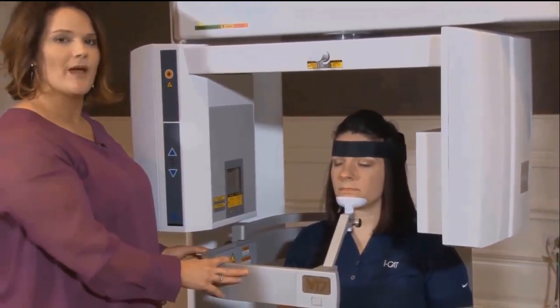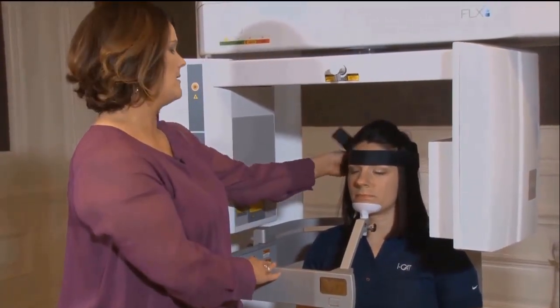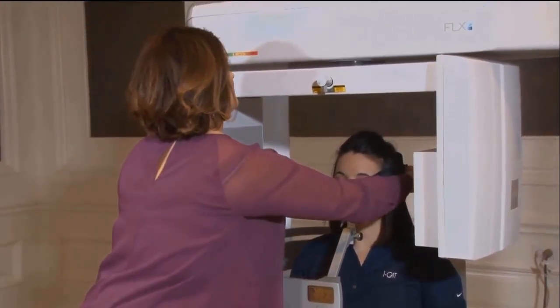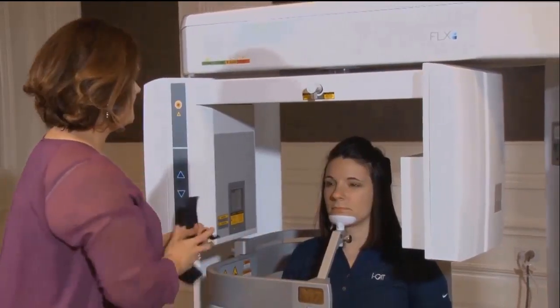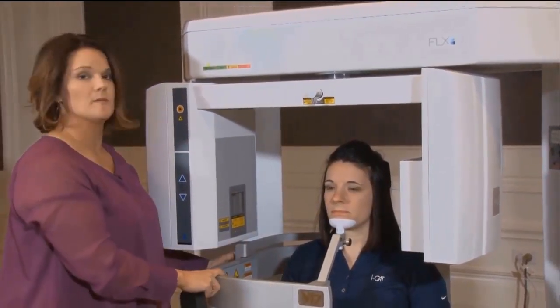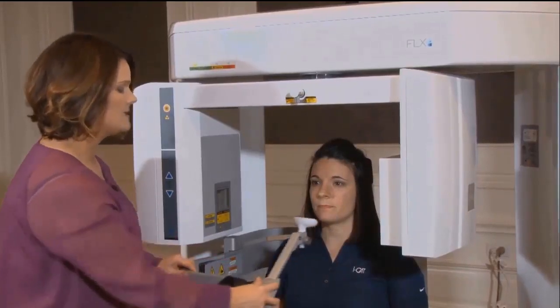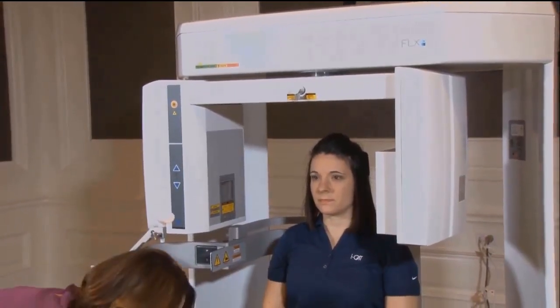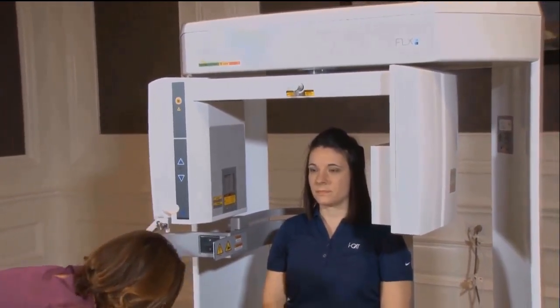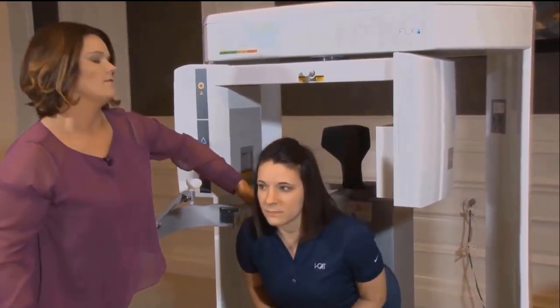Now I'm going to go ahead and release my patient from the machine. I'm going to open the gate as well as remove the footstool, lean my patient forward, and have her step out.